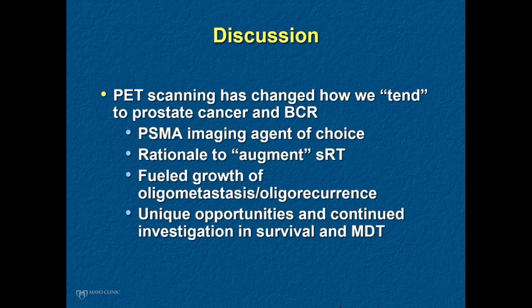So to conclude my talk, certainly PET scanning has changed how we actually tend to treat prostate cancer now, especially in biochemical recurrence. And I think out of all the disease states we see, the most relevant place for a PSMA PET is in the evaluation of biochemical recurrent disease. And obviously PSMA is the imaging agent of choice.